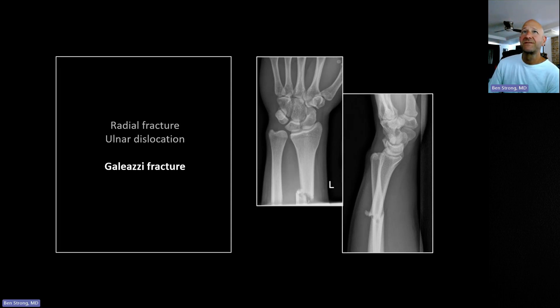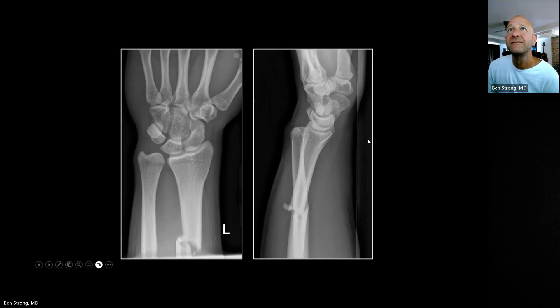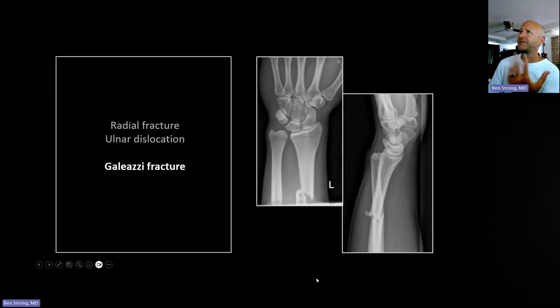For wrist effusions, look at the anterior aspect of the distal radius on the lateral view. The pronator quadratus muscle lies there, and you'll normally see a relatively thin soft tissue shadow in that region. When it becomes indistinct or truly bulging, that is how you identify a wrist effusion on a lateral radiograph.